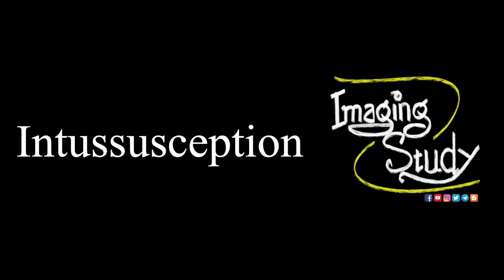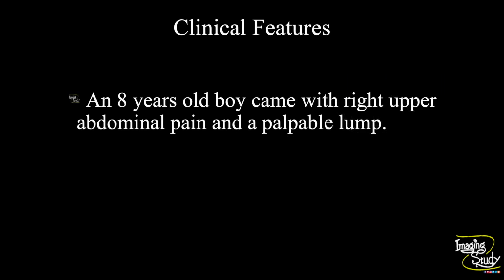Today we are going to see a case of intussusception. Am I the only one who can't remember this spelling? An 8-year-old boy came with right upper abdominal pain and palpable lump. Let's see what we have got on ultrasound.